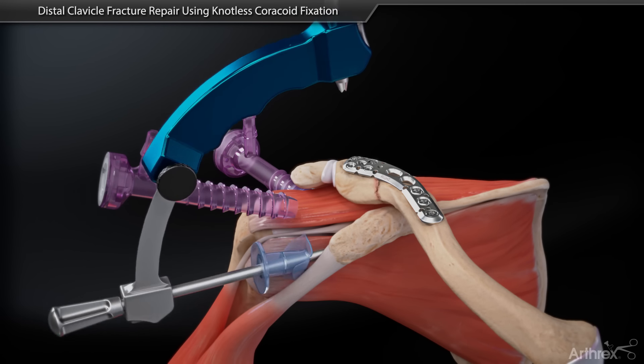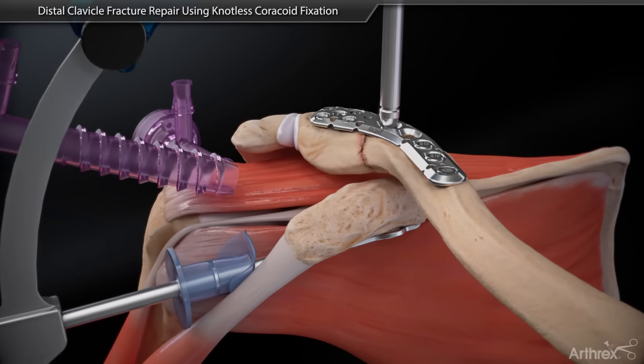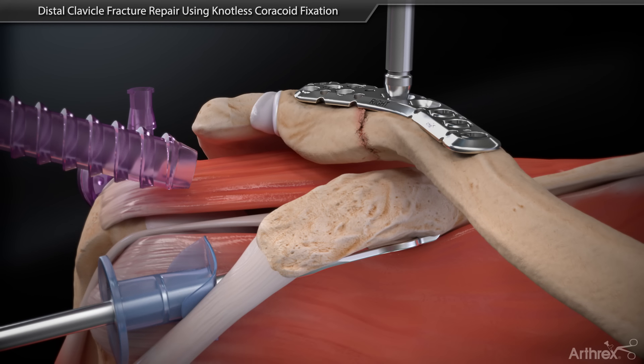Place the AC guide at the base of the coracoid, place the drill sleeve in the plate slot, and drill a three millimeter tunnel through the clavicle and coracoid.